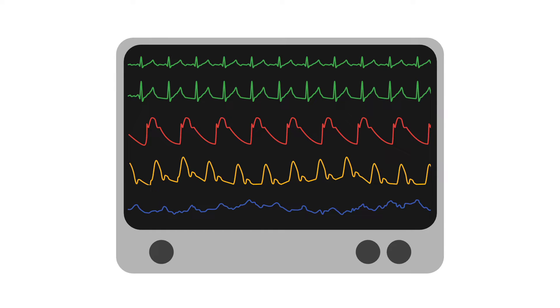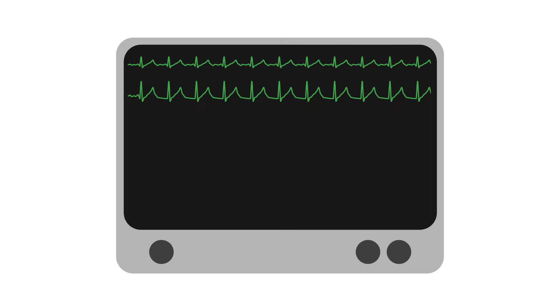Let's see if you can identify the following waveforms from an ICU patient monitor. As I ask you questions, take a moment to pause the video and give yourself a chance to answer. Starting at the top, we see two green waveforms. Those should be familiar as ECG leads, showing us heart rate and rhythm.